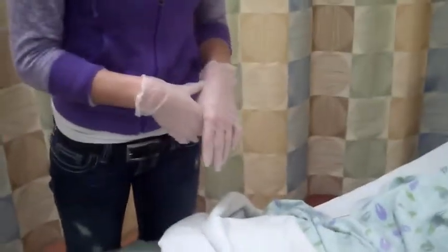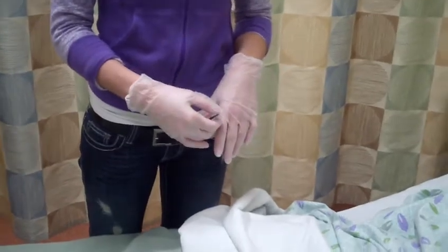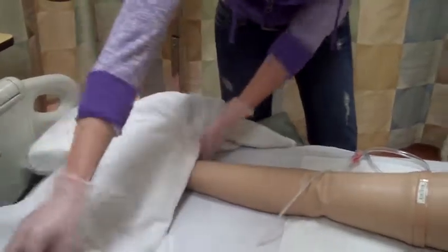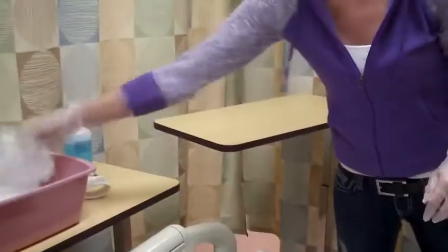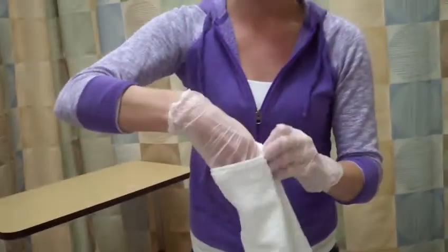So I would explain the procedure to her. Ms. Jones, we're going to be inserting a catheter, and I would have checked for allergies to latex or iodine, which she does not have allergies to either of those. So Ms. Jones, I'm just going to uncover the bottom portion of you here, and I'm just going to take a wet washcloth that was in warm soapy water.